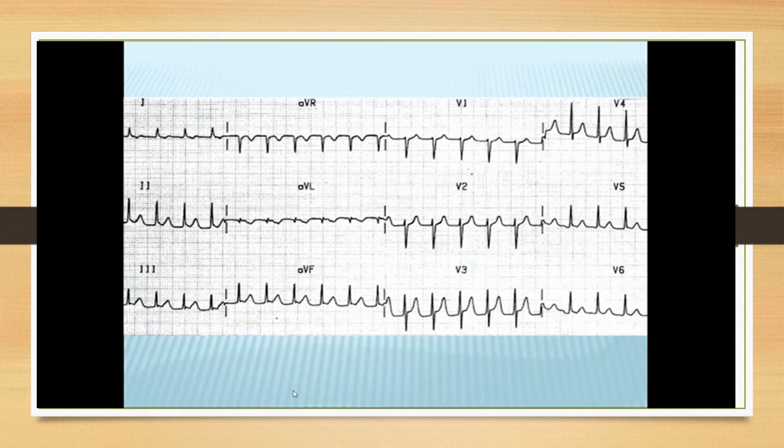So now we will find the electrical axis position. As we can see, R2 is highest, and I told you if R2 is highest, your conclusion must be vertical position of electrical axis. R2 is greater than R3 and R1. Normally if R2 is bigger, then we are talking about normal position.